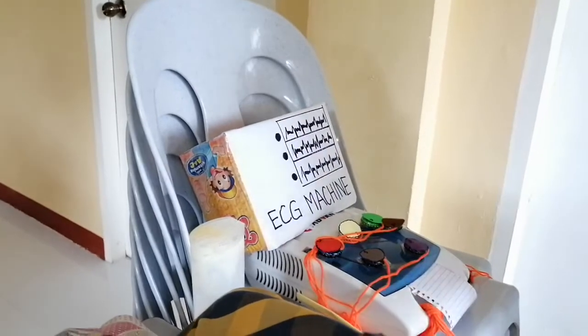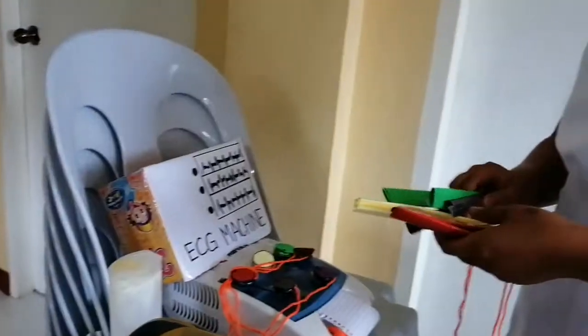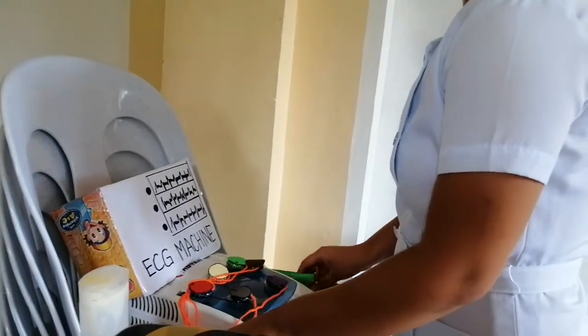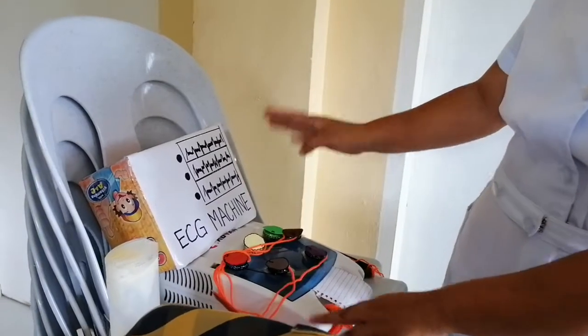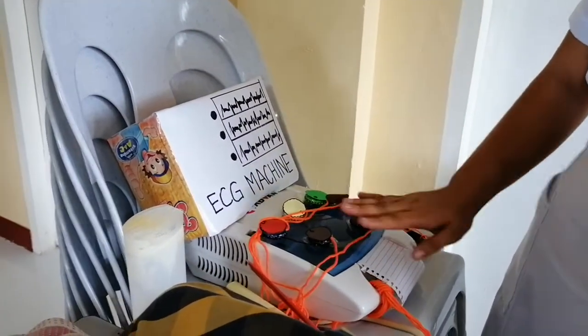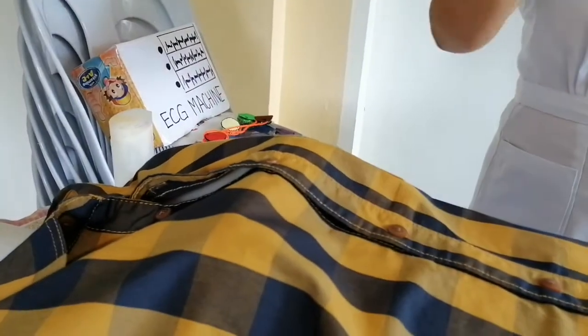The 4 limb leads are attached to the lower and upper extremities, the right and left arms and legs, and I have the 6 leads with different colors to be placed on the chest of the client while doing the procedure.